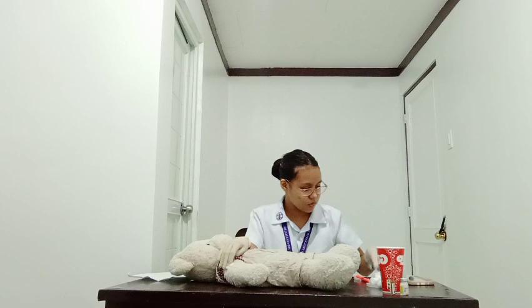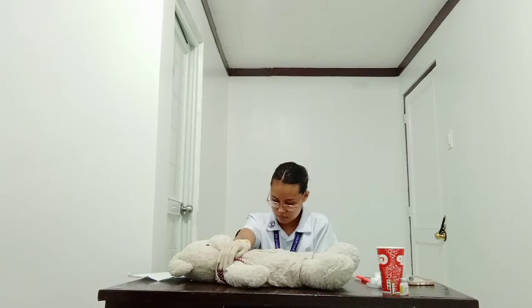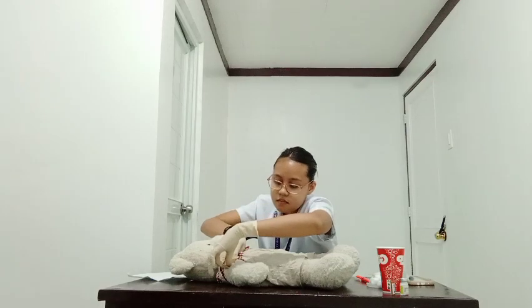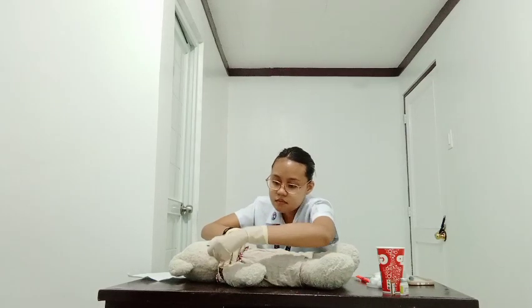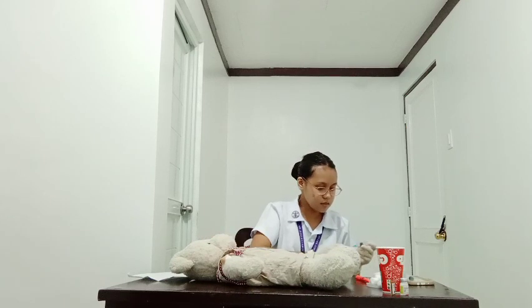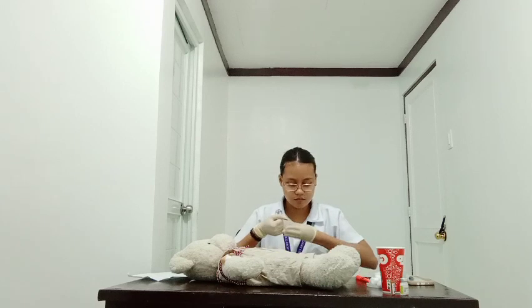So before that, we need this. So, and then discard this. Now we need to remove and discard gloves and perform hand hygiene to deter the spread of bacteria and prevent contamination.